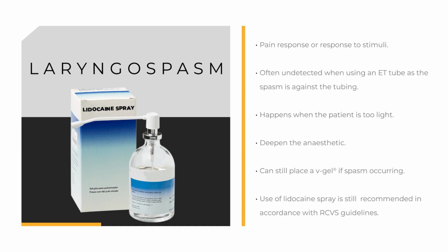It's for this reason that the use of lidocaine sprays is still advised, as well as being in line with RCVS guidelines. If you usually use a lidocaine spray as part of your usual anaesthetic protocol, our advice is that you continue to do so.